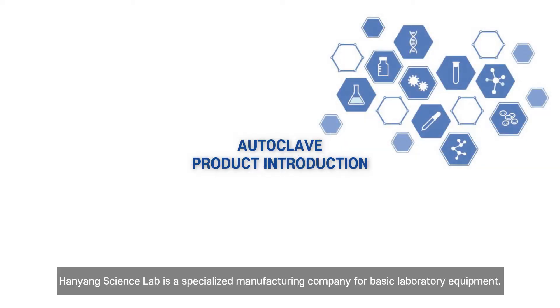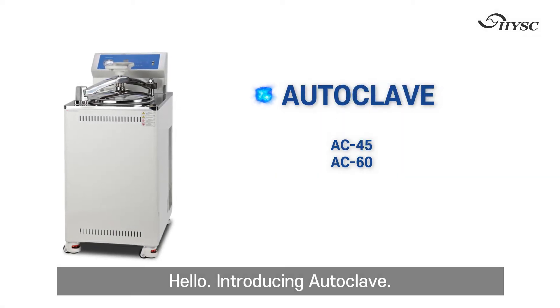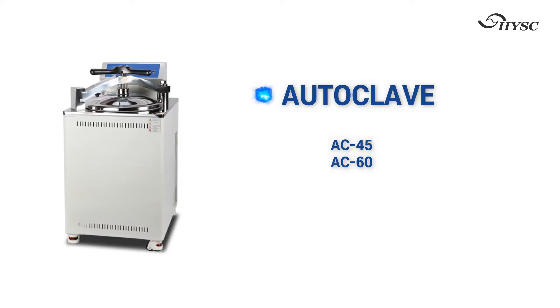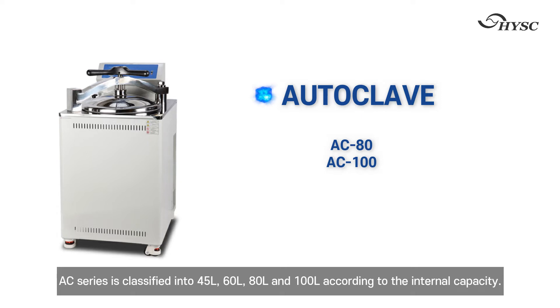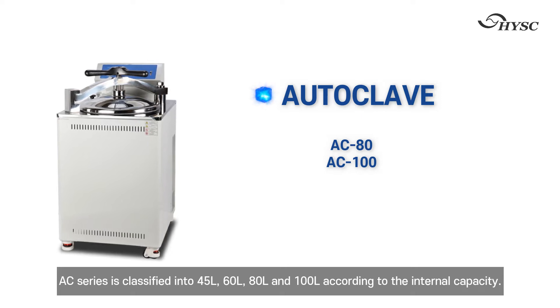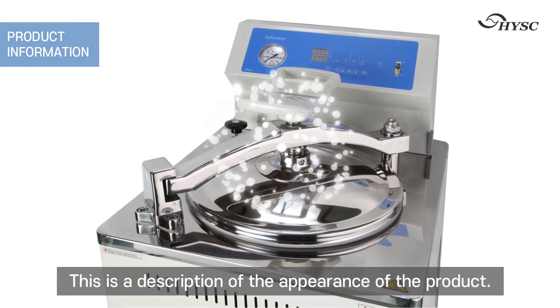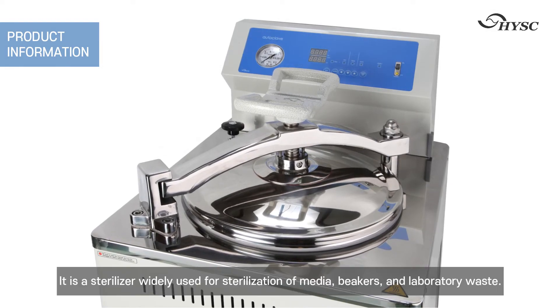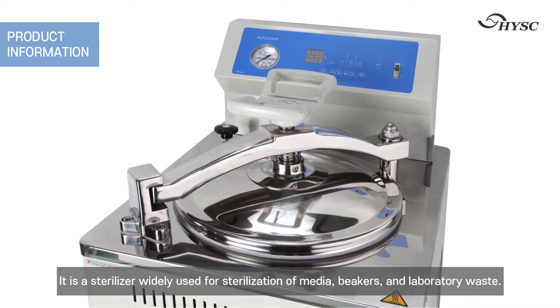Hanyang Science Lab is a specialized manufacturing company for basic laboratory equipment. Introducing the Autoclave AC series, which is divided into 45 liters, 60 liters, 80 liters, and 100 liters according to internal capacity. This is a description of the appearance of the product — it is a sterilizer widely used for sterilization of media.